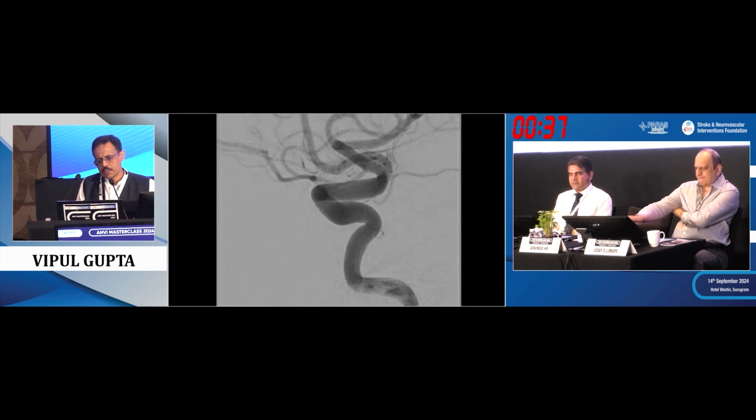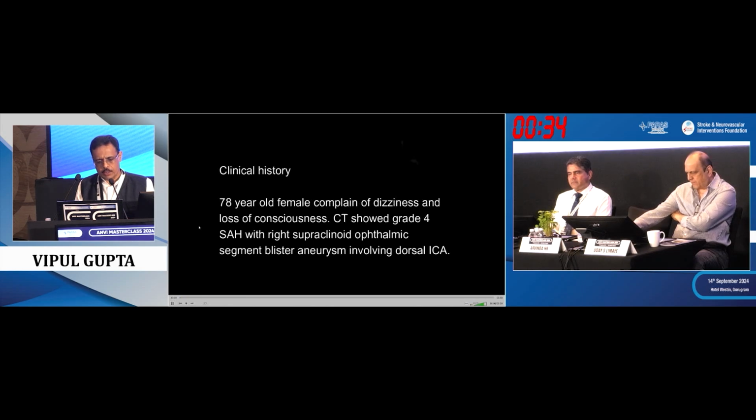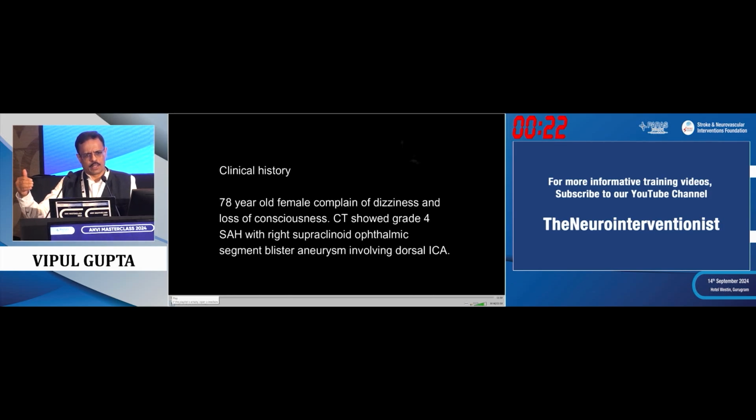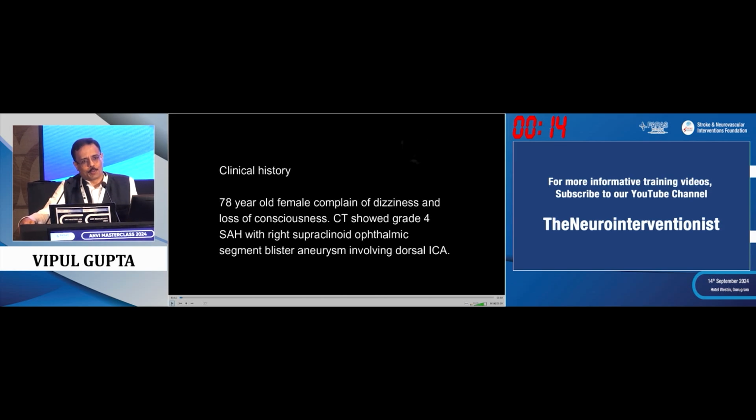And in our experience, yes, we do cover the anterior cerebral artery in these patients, but usually there is an ACOM, and to me, a bleeding complication kills a patient. So you have to cover it, and usually since the flow diverter is slightly oversized, the ACAs remain patent, or they get taken over by the ACOM. Initially, it was a worry for us because in subarachnoid hemorrhage, vasospasm can also come in, but somehow we have realized it has worked well, and we don't get too many ischemic complications in these patients. So, this is my department's technique in handling blister aneurysms.